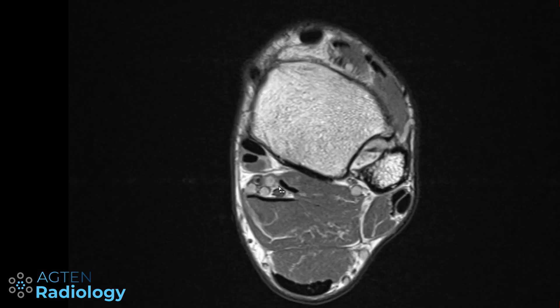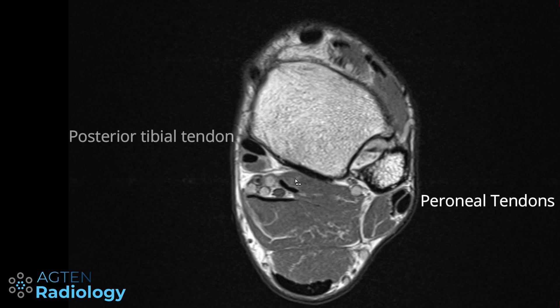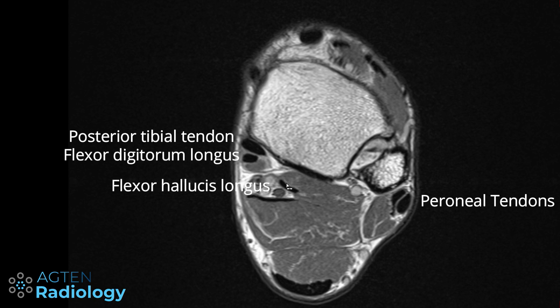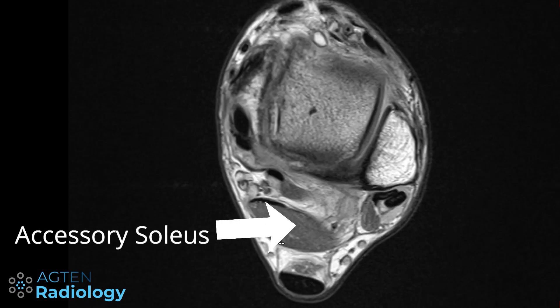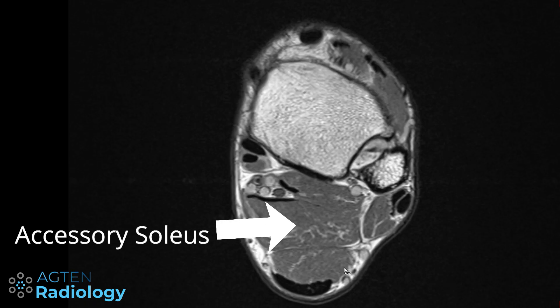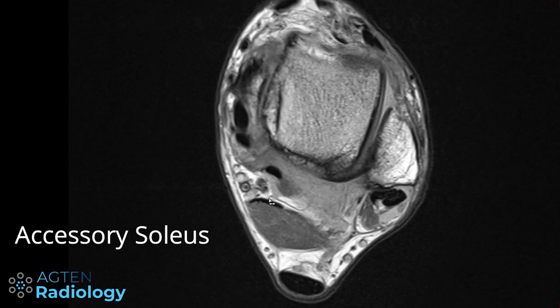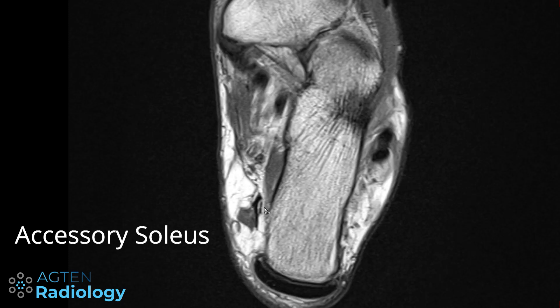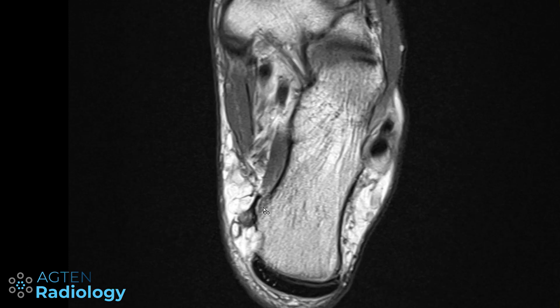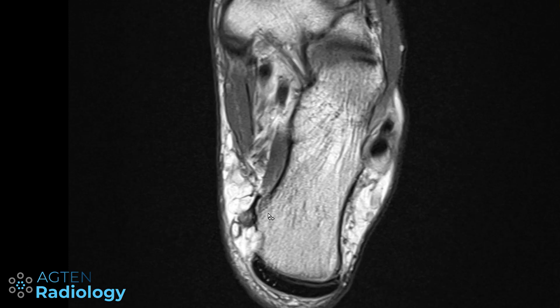We have the normal tendons: the peroneal tendons, the flexor tendons — the PTT, then the flexor digitorum longus, and the flexor hallucis longus — and then the accessory soleus here. This is the Achilles tendon with the normal soleus, and this is just the accessory soleus muscle with its corresponding tendon inserting here onto the medial aspect of the calcaneus.